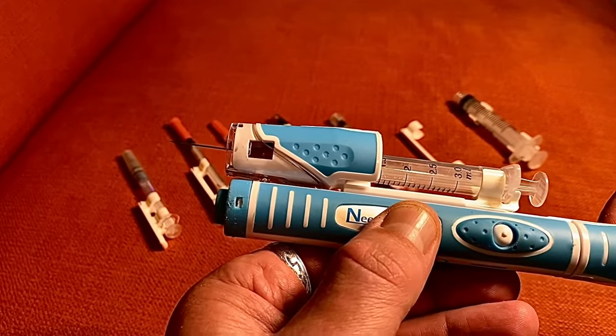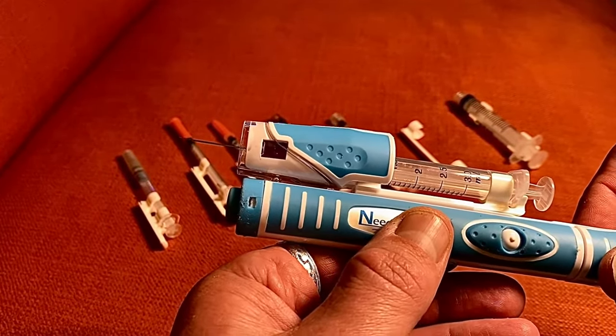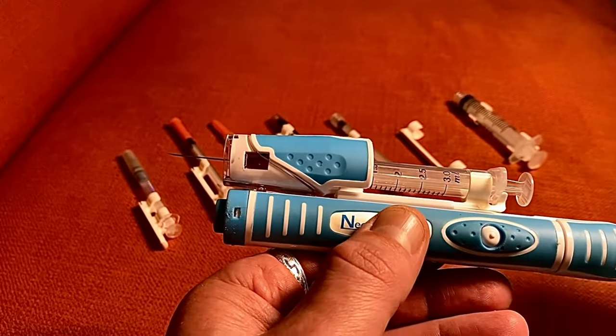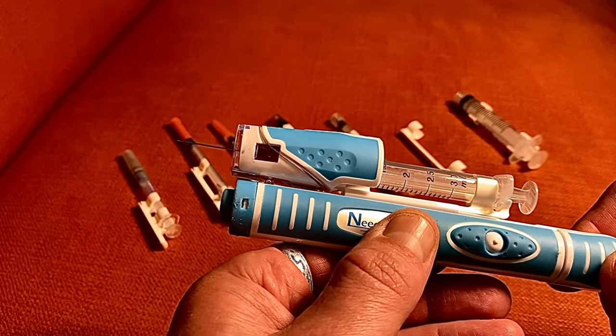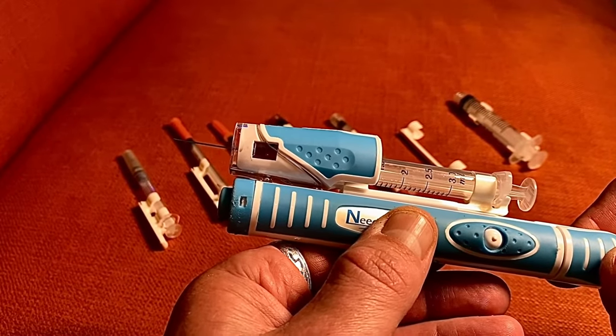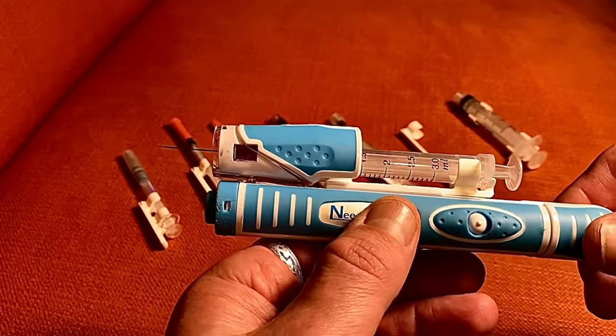Especially if you're using a one and a half inch needle, that's plenty long for any intramuscular injection. Many people use inch and a half needles in clinic. We primarily use one inch for intramuscular injections in the glutes and the quad for ventroglutes, and then a half inch needle for deltoid injections.